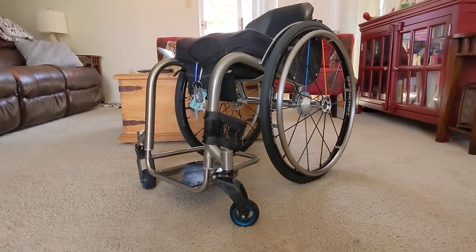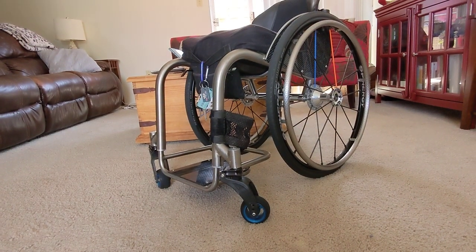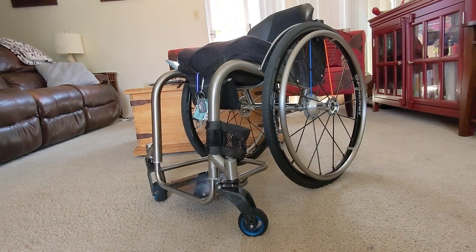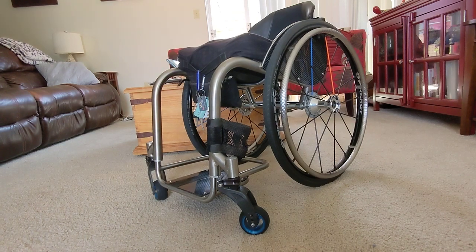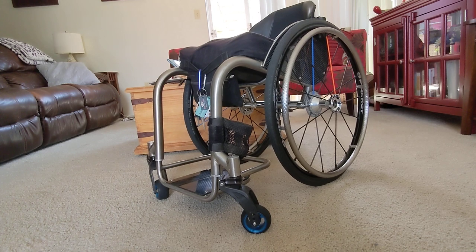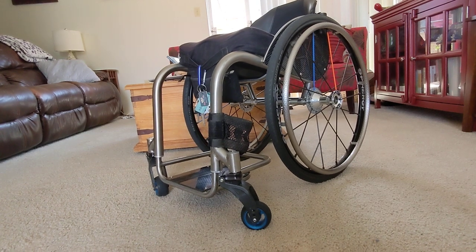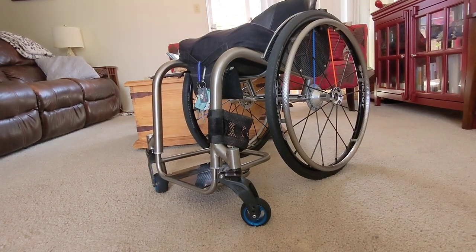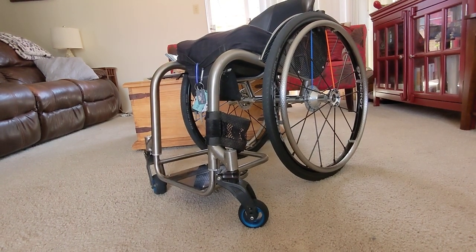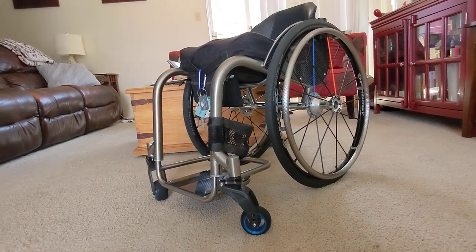Hey guys, I wanted to give you a brief tour around my new wheelchair that I had made by the guys over at Hands-On Concepts in El Cajon, California. I am super stoked on this build. It's been about a month now, so I've had some time to shake it down and get used to it, and I cannot say enough about this chair — it is absolutely what I wanted and more, with high expectations going in.